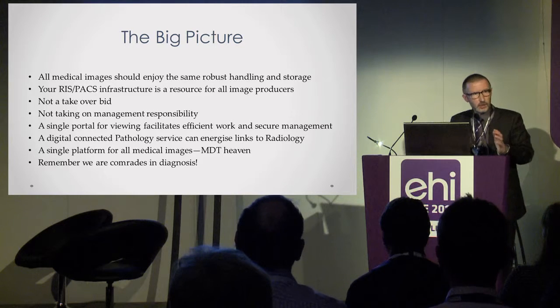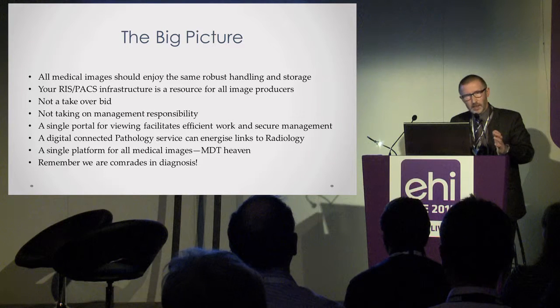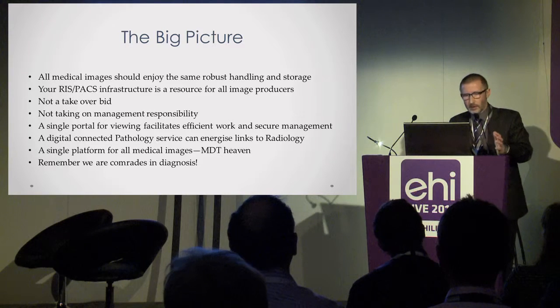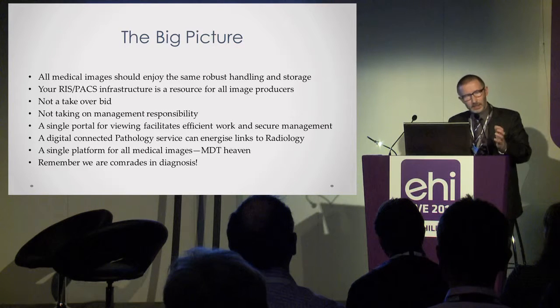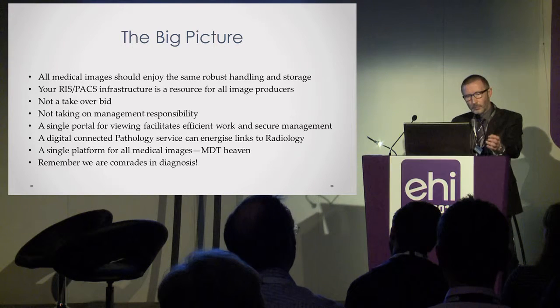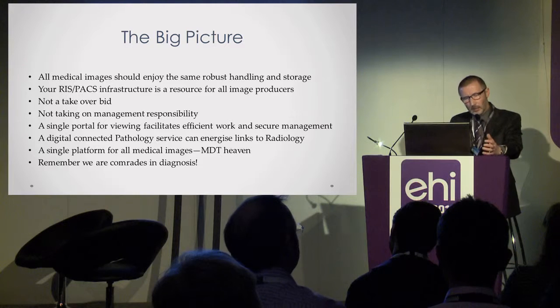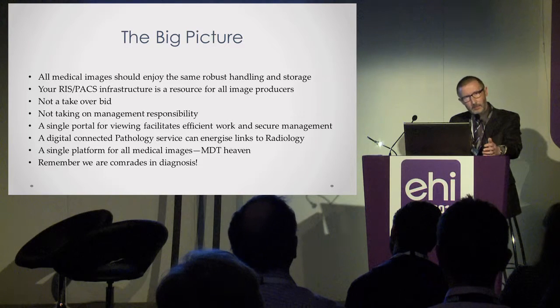And if we can give our clinicians a single portal for viewing all their images and reports, then we will energize and make more efficient their work. And in particular, with relevance to pathology, a digital connected pathology service would energize our links to radiology, improve our relationships with our pathologists. And remember that a single platform for all our medical images would be MDT heaven and improve our discussions.